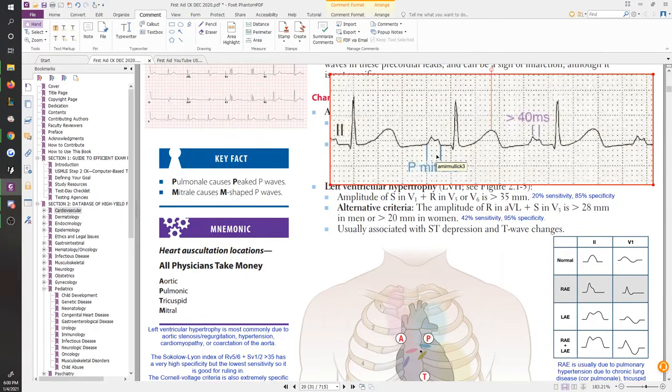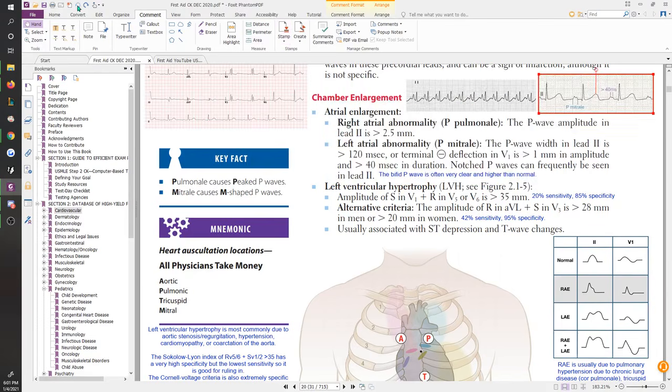Remember that the P wave was actually due to atrial contraction, right? So if you have an issue with atrial contraction, you want to start thinking of what might have been causing it, okay? If you have a P mitrale thing happening like this with the M sign, and you can keep seeing it, it happens in the next one and the one after that, that's a sign that you have left atrial problems. If you have a P wave that's super tall, that is a right atrial problem, and that would be your P pulmonale, okay? So not so bad. Obviously, you look at your P wave for your atria, and that's what we're learning here.